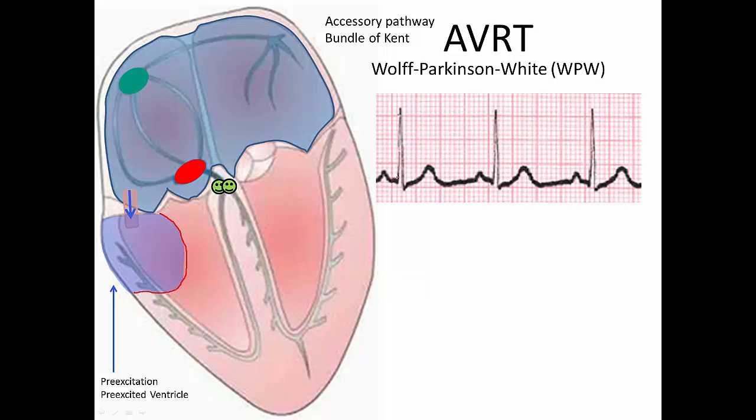And so if we look at the ECG to the right, I'm going to draw what's happened here. Remember this PR interval here? This is during the AV node time. So I'm going to draw it right over here.